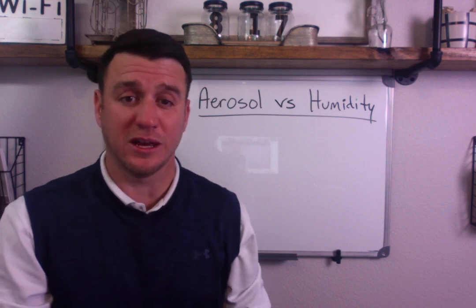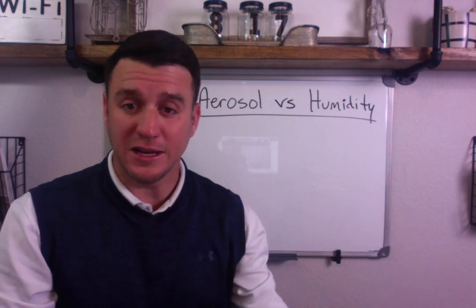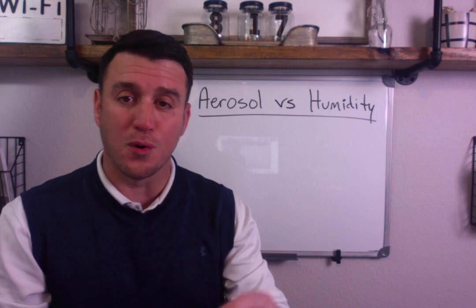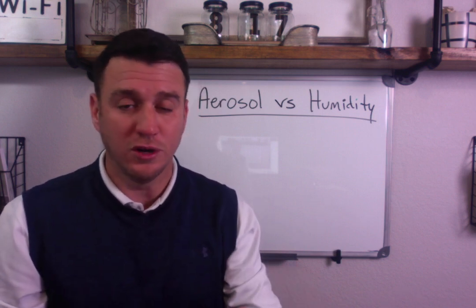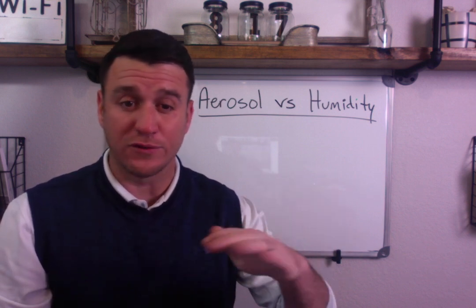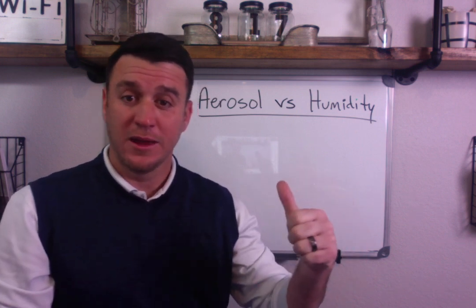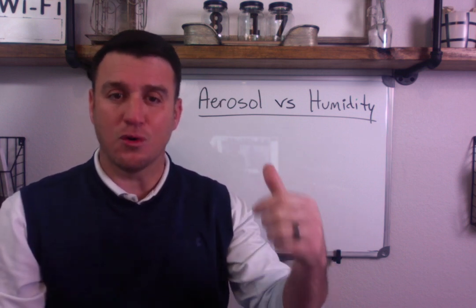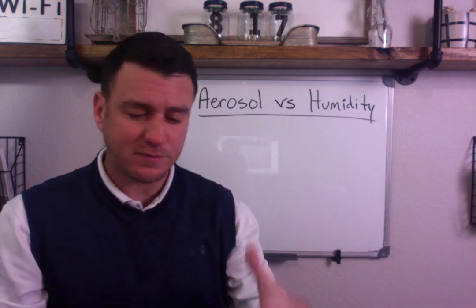The second thing you want to understand is that aerosol has larger particles than humidity. Now, the fact that it has larger particles makes aerosol more likely to be associated with cross-contamination or infection due to the equipment that you're using. Okay, so those are the two big things right off the surface that you need to clarify. Understanding that aerosol is visible. Why is it visible? Because it has larger particle sizes, and that makes it more susceptible to associated infections and cross-contamination. So we're going to start there.